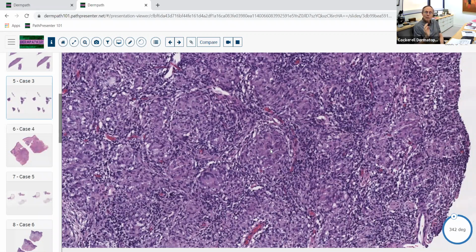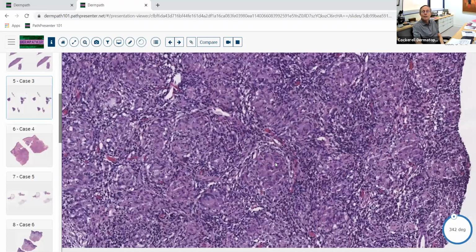And then we also see sarcoidal granulomatous dermatitis associated with tattoo reactions. Lots of people get tattoos today, and especially the vegetable tattoos, when they get tattoos that contain vegetable-like material or plant-based dyes. People that get their eyebrows tattooed or their eyelids tattooed, eyelashes, those very commonly will give you a sarcoidal granulomatous pattern. So this is a nice example of sarcoid.